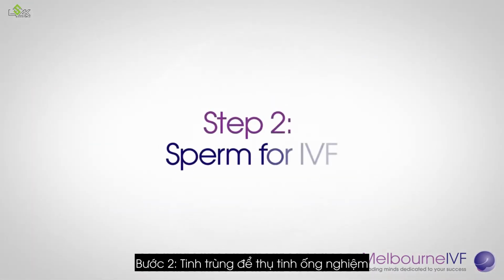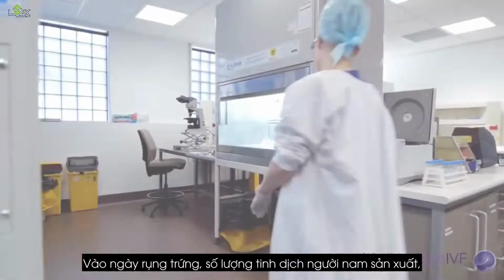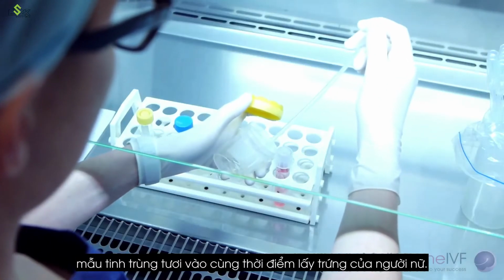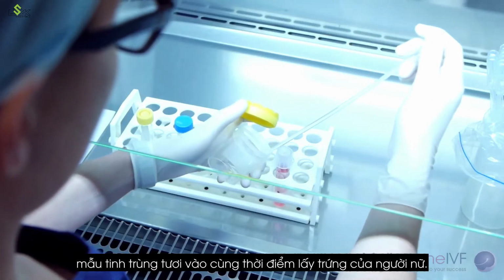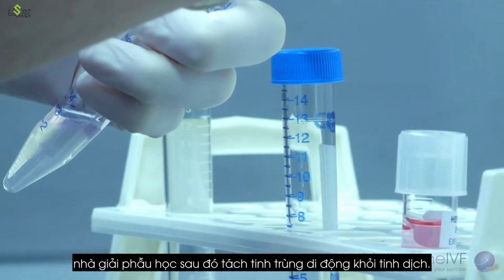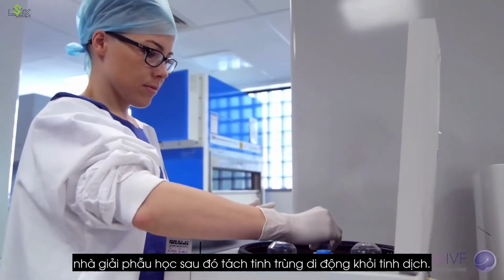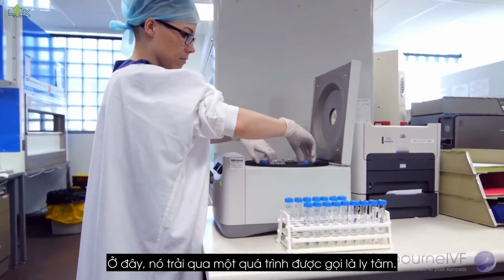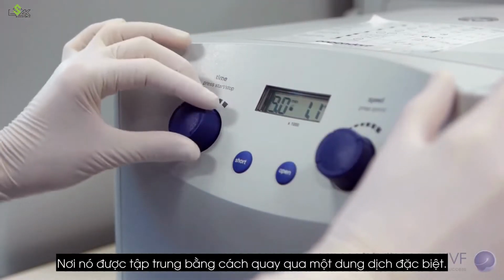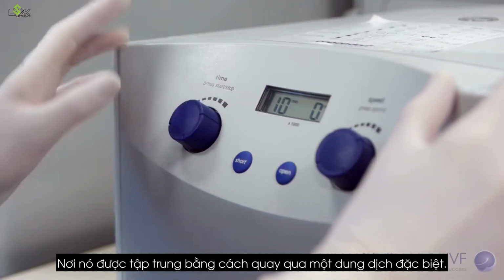Step 2. Sperm for IVF. On the day of egg collection, the male partner produces a fresh sperm sample at about the same time the female's eggs are collected. In preparation for IVF, the embryologist then separates the motile sperm from the seminal fluid. Here it undergoes a process called centrifugation, where it is concentrated by spinning it through a special solution.